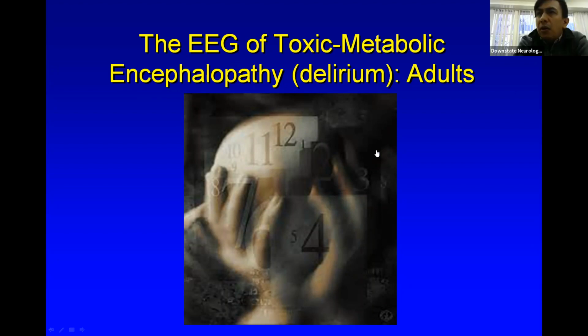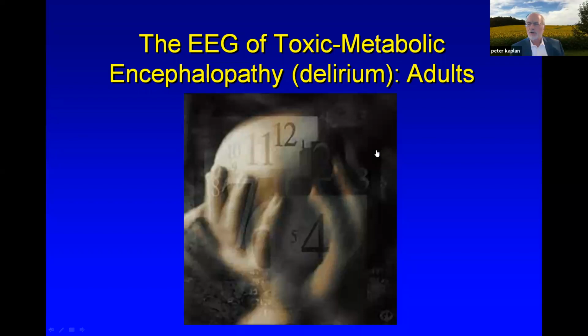Okay, there's another question. This is coming from one of our residents. Is if you can explain a little bit better the difference between the bilateral intermittent discharges and burst suppression. The difference between burst suppression and bilateral intermittent discharges.